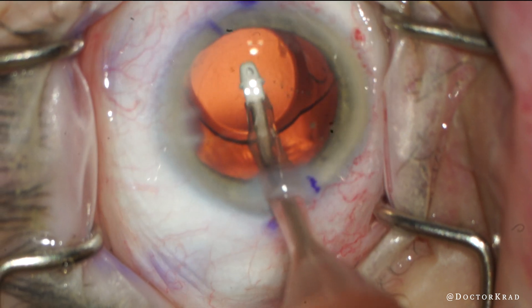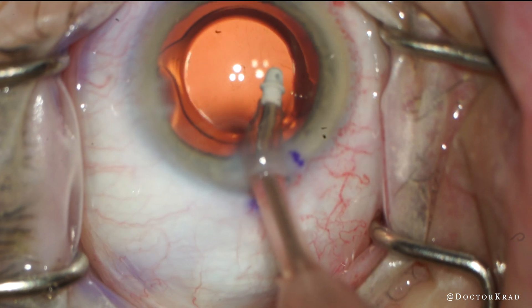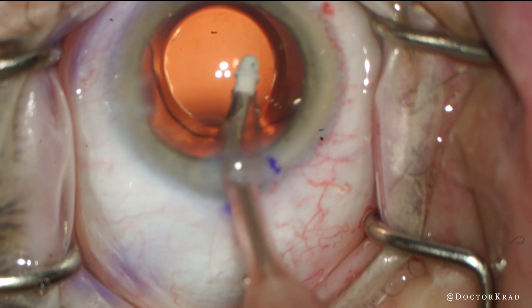So I remove the viscoelastic from behind, and now I'm going to come in front. I tilt the optic from different sides to make sure that I get any trapped viscoelastic.